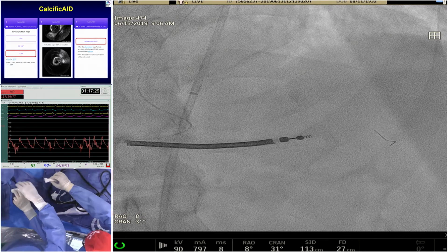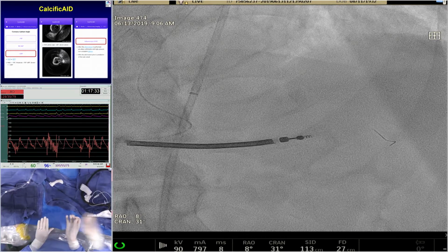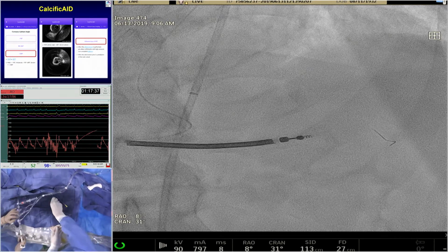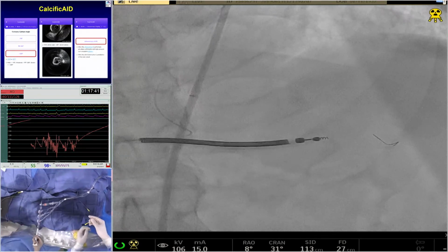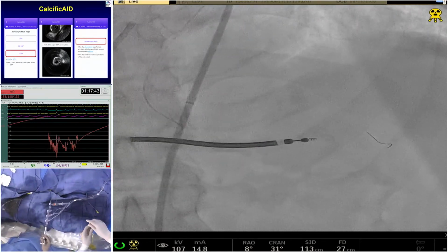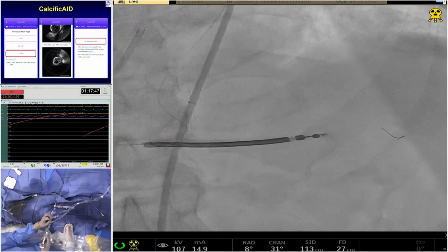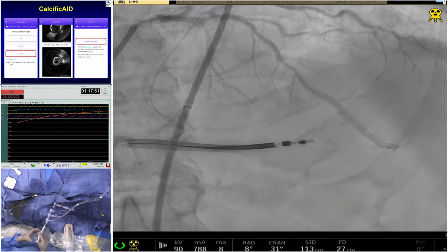But Roxana, the point of LV support with Impella, I think if used here will not be against. Many people will use it, and that's the right practice nowadays, for that complex lesion even with a normal ejection fraction. So our threshold is a little high. We still keep that same old protocol of EF of less than 35 for Impella, but in rare cases we can still decide. Look at the flow now.